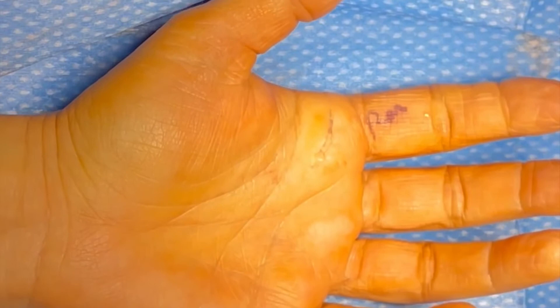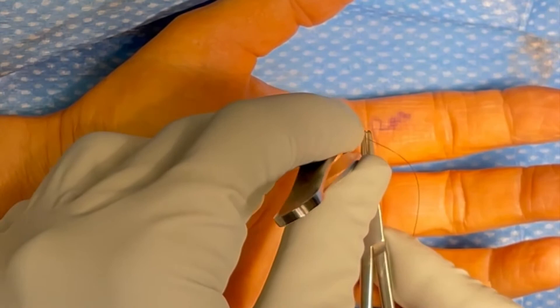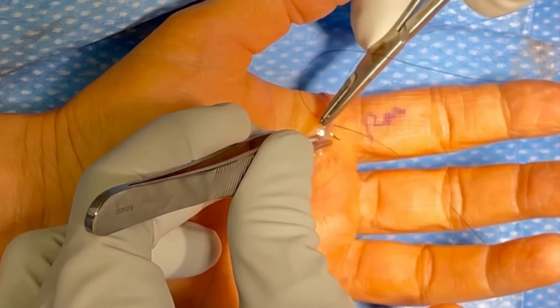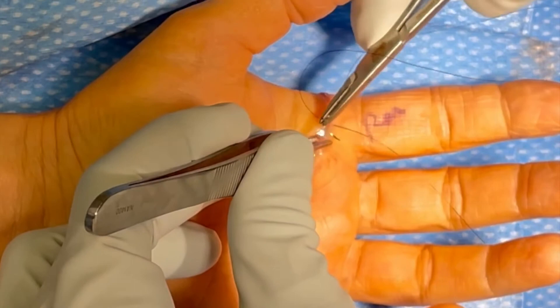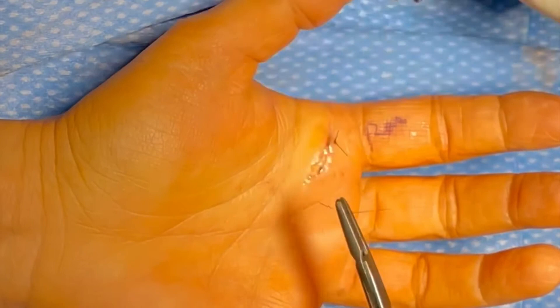The A2 pulley is found over the proximal phalanx and the A4 pulley is found over the middle phalanx. You can remember the pulleys by the odd numbers being over the joints and the even numbers being over the phalanges. So the A1 pulley sits over the metacarpophalangeal joint, A2 over the proximal phalanx, A3 over the proximal interphalangeal joint, A4 over the middle phalanx, and A5 over the distal interphalangeal joint — going from proximal to distal.